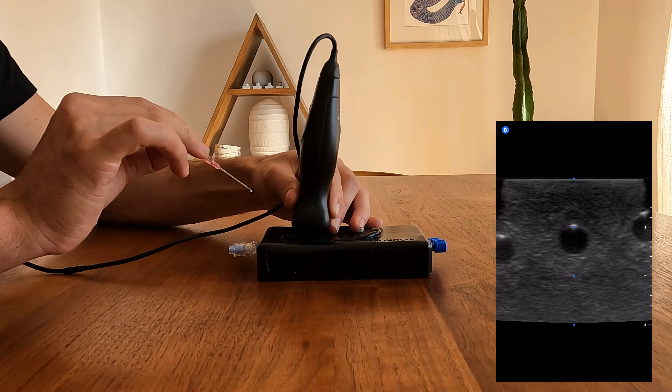Let's review the leading the needle technique. Notice we're in a short axis view of the vessel, as can be seen on the right side of the screen. I have my probe held with a C grip and notice my fingers are planted comfortably against the phantom, taking the weight off the probe. We're ready to start the procedure.